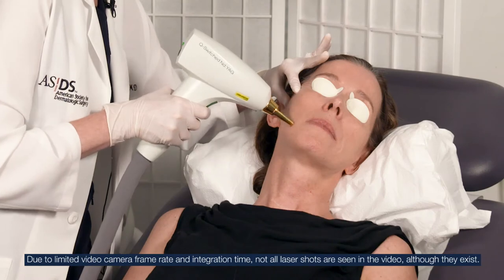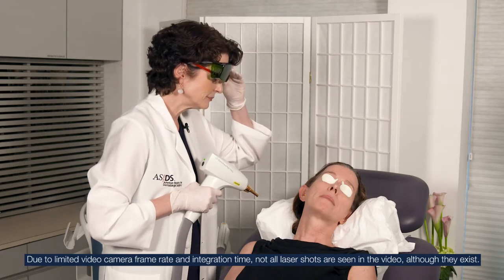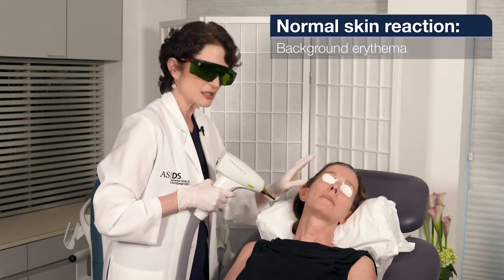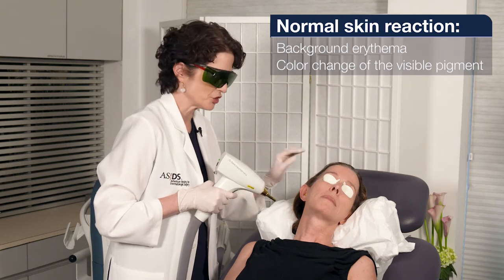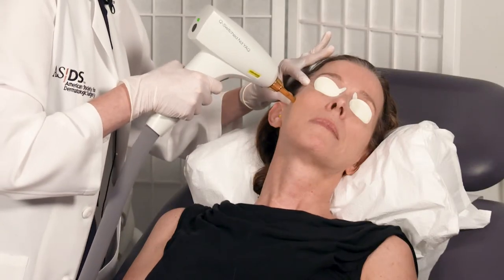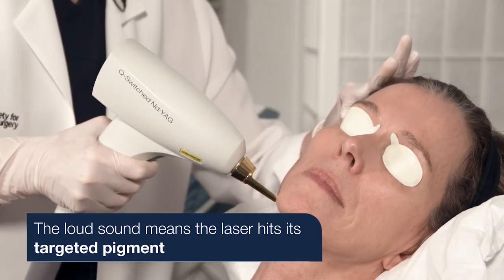How's that? This is great — there's just a little bit of background erythema and maybe one of these lentigines has a little bit of whitish color change. This is perfect. Here we go. There'll be those loud snaps when we're really connecting with some pigment.